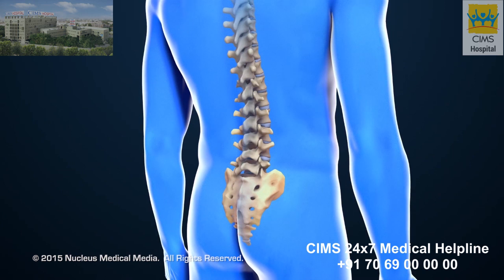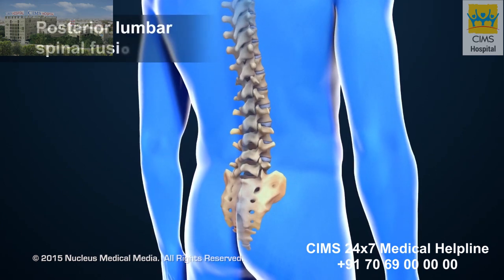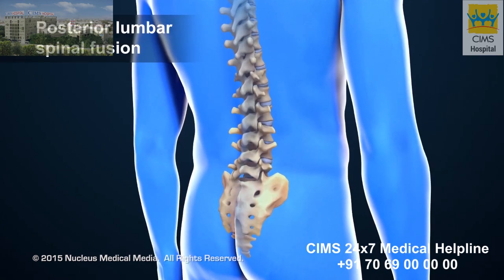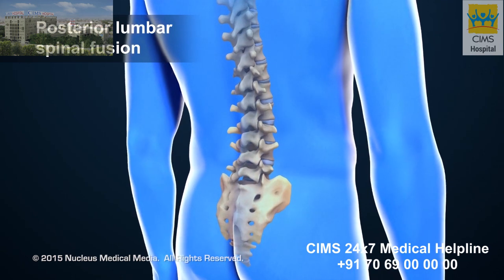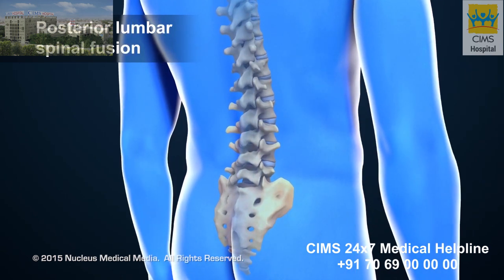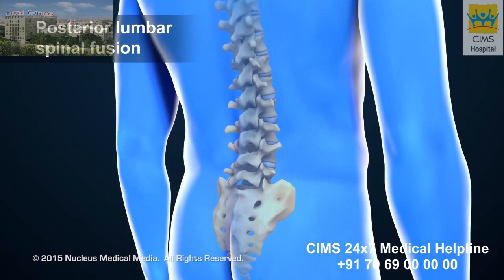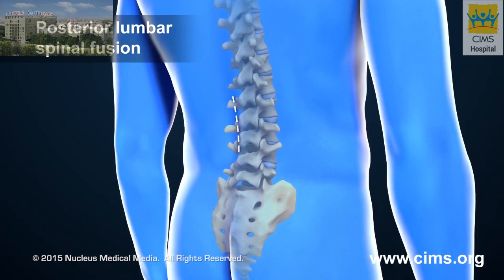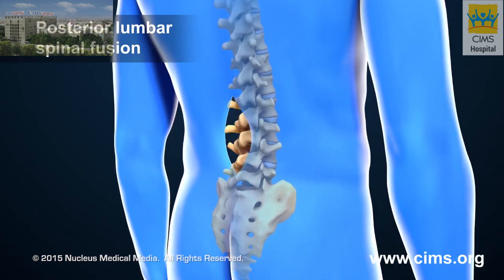A doctor may recommend a posterior lumbar spinal fusion to make the spine more stable and decrease pain due to a condition, injury, or abnormal curve. To begin, the surgeon will make an incision over the lumbar spine.